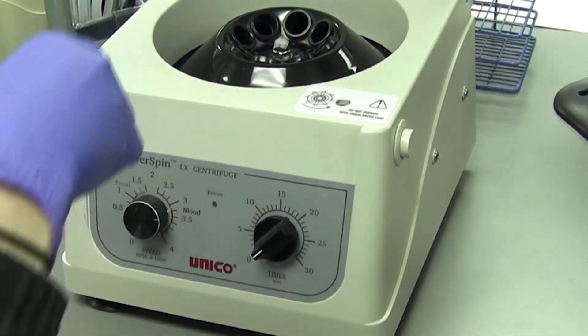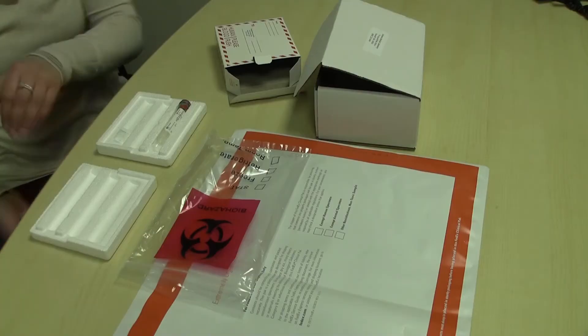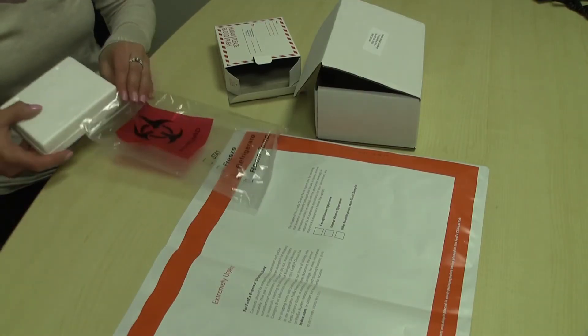Once collection is complete, make sure your name and date of birth are labeled on the tube. The tube needs to be placed into the protective styrofoam with the absorbent pad.